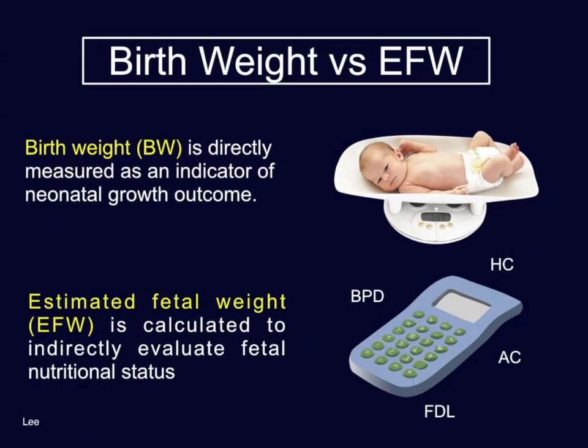It is especially important to recognize that birth weight has been used with crown heel length for years by pediatricians for evaluating neonatal nutritional status. By contrast, EFW is a calculated composite parameter that is based on several ultrasound measurements. This calculation process is not the same as placing a baby directly on a weight scale.